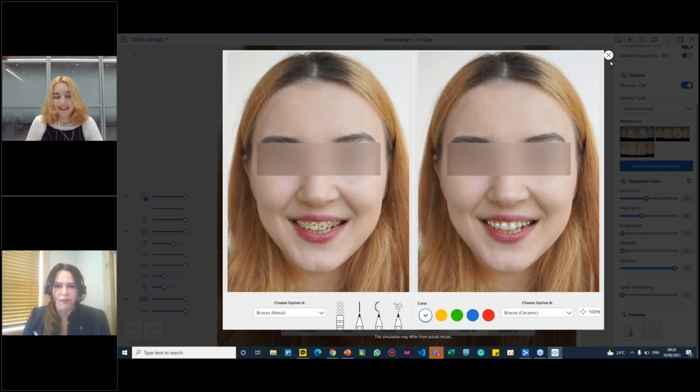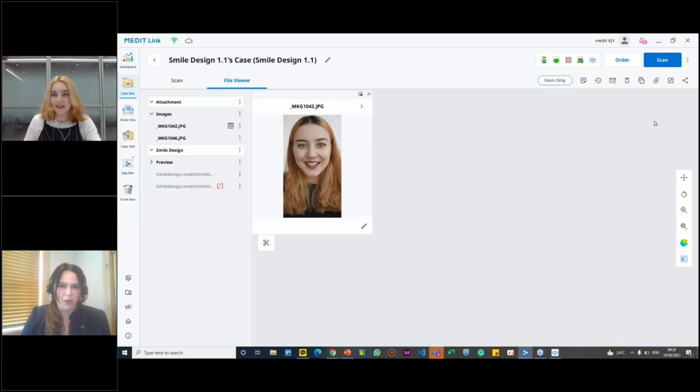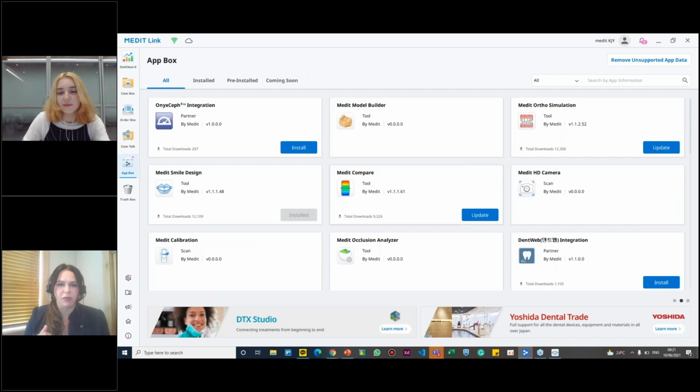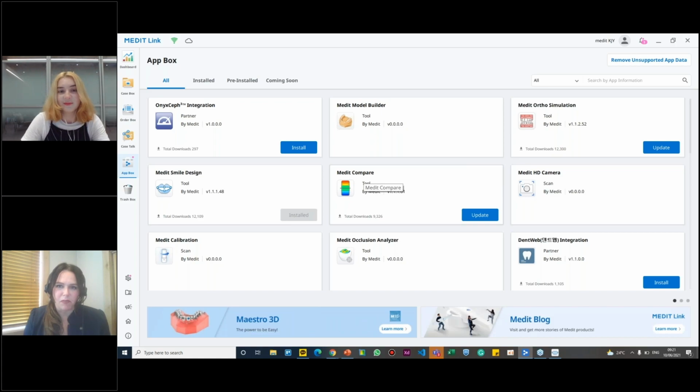We do have one question from Scott. Scott would like to know when the next webinar is and which one it will be. I'm pretty sure that's Medit Ortho Simulation. I believe so. And you will also be taking us through the process there. Like I mentioned earlier, it will be every month generally, but because we want to get these apps out to the public as fast as we can, to the end users, to the trainers, and whoever else, we're going to do an app every Wednesday. So plan on joining us.